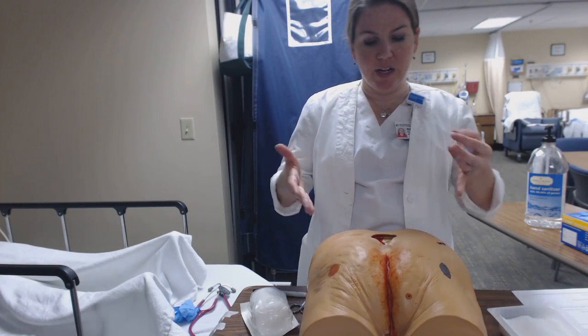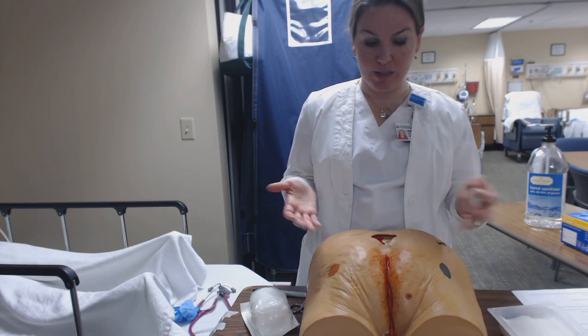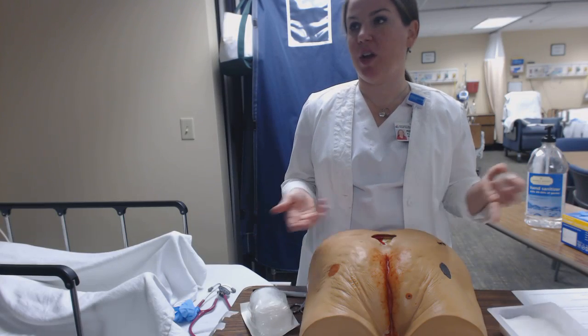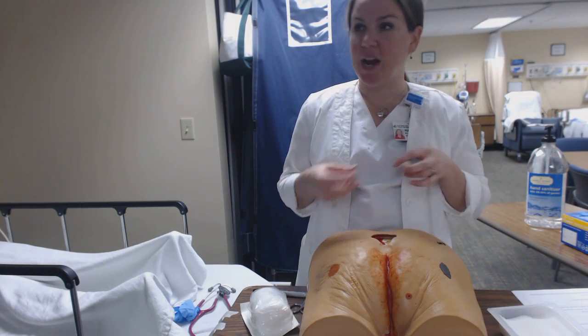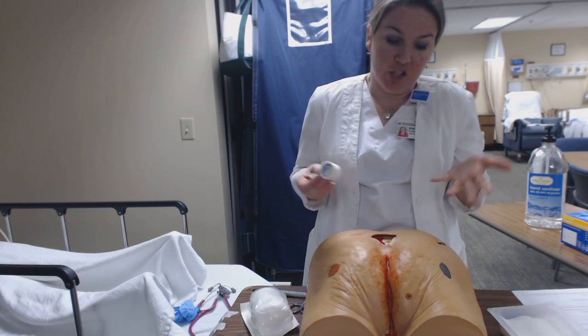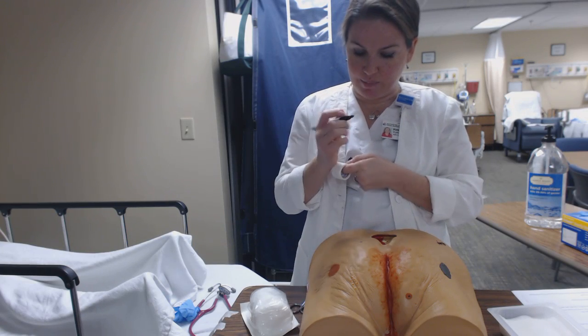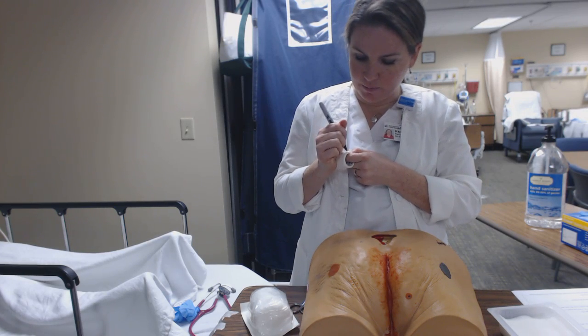Okay. If you get it on there and you are new at taping things, because you were all new at that, and you don't have enough, then you can pull out another piece later. But this way, I'm not trying to fight with the tape with my gloves on later. Okay. And that's just a personal preference. Okay. So now I'm going to put my date and time on here.